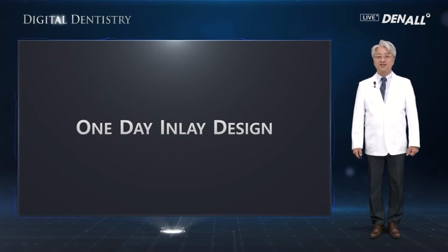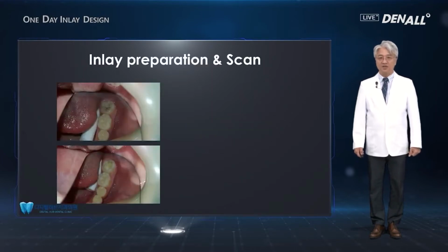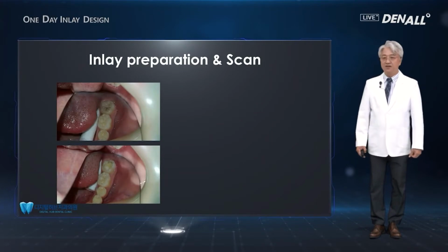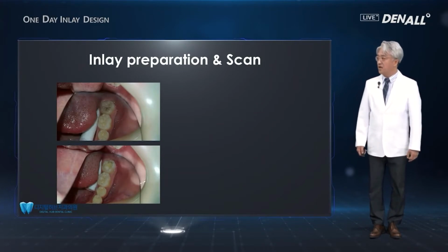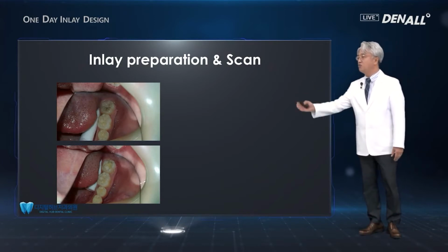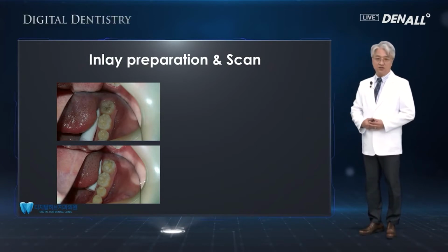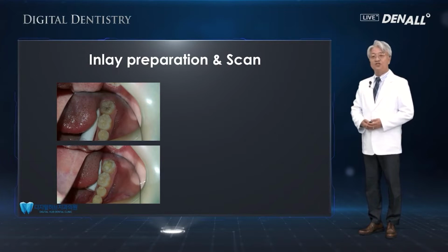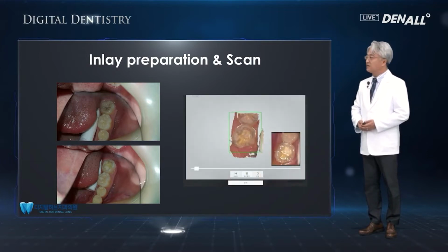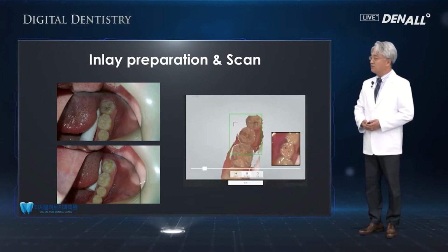Today, we are going to look at part 8 of this lecture series on the one-day inlay design. First, when it comes to inlay, this is a case where I did a one-day inlay. Due to caries on number 37, inlay treatment was planned, and as you can see, preparation was done, and then using the oral scanner, you can see the scanning is also done.